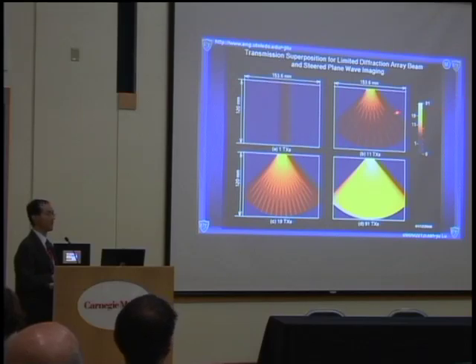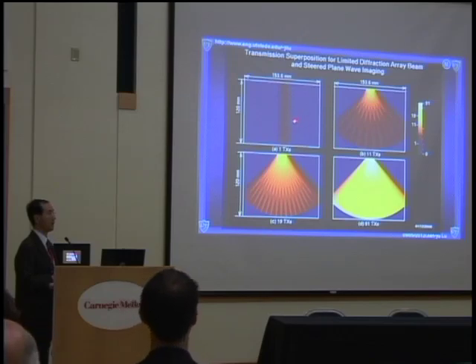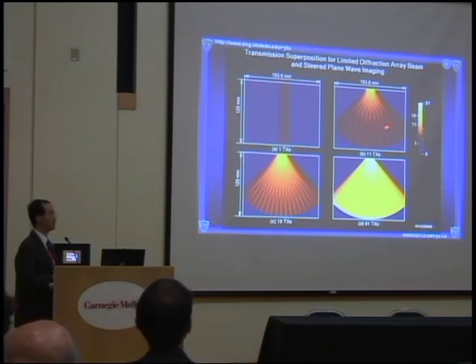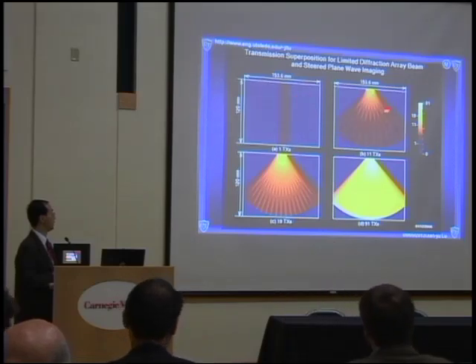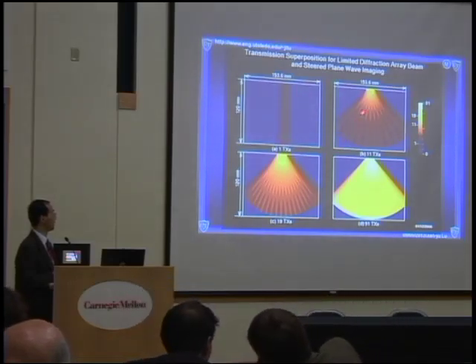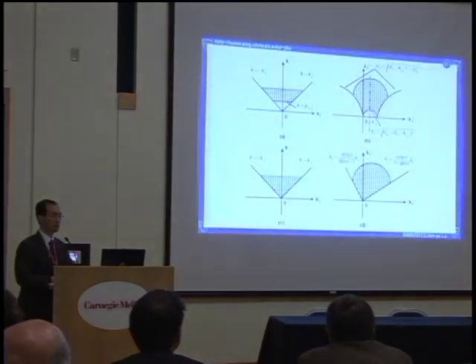The transducer size is usually like 2 centimeters, so you can construct an image one at a time with centimeters of width. That's not enough to see the entire heart; you would like to see wider areas. If you use a little bit divergent beam, then you can use fewer transmissions to see the entire heart. But if you use plane waves, you see a narrower area, and then put them together to get an entire larger field of view composed image.